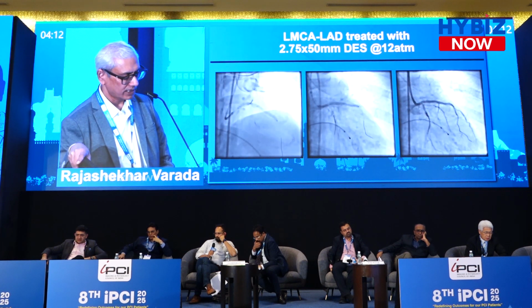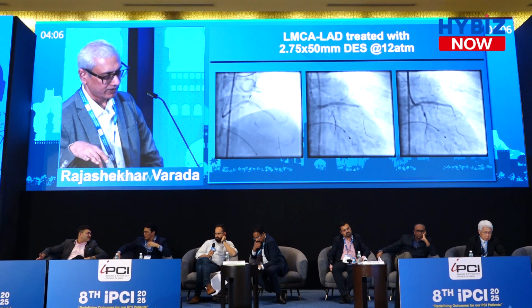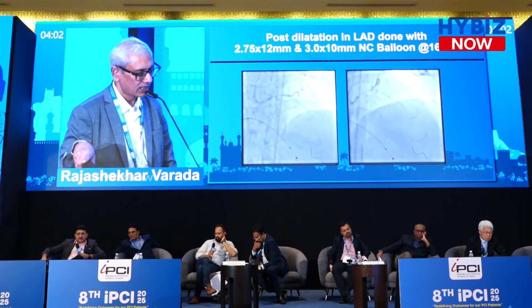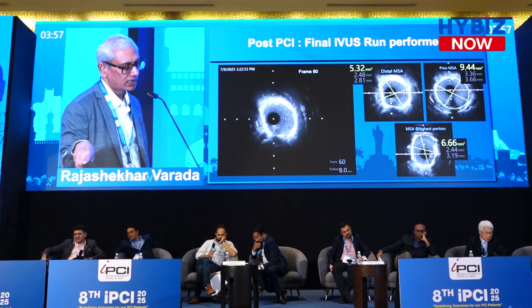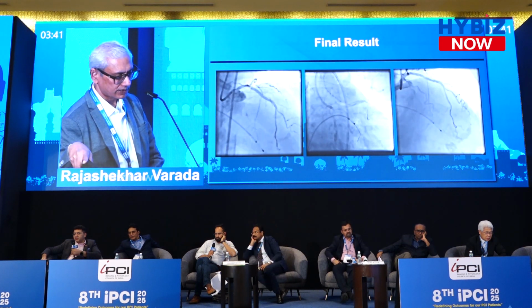So this is the stent, and it's a 50 millimeter stent. It's a 2.75 Nagomi stent. This can go up to 4.5. That's the reason why we picked this stent. And post-dilatation, the final result. That's an excellent result, the final angiographic result.